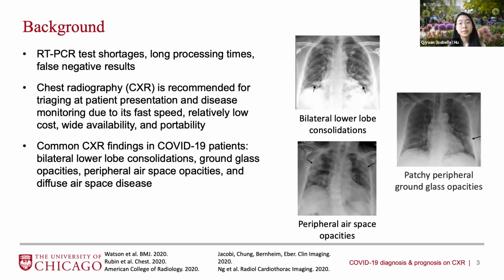Moreover, the RT-PCR tests have moderate and variable sensitivity in clinical practice, so repeated testing is recommended, which reduces false negatives, but also increases the waiting time. And those are some of the reasons why imaging is valuable in this case, because imaging exams can provide clinically actionable results, either for establishing a diagnosis or for guiding patient management.